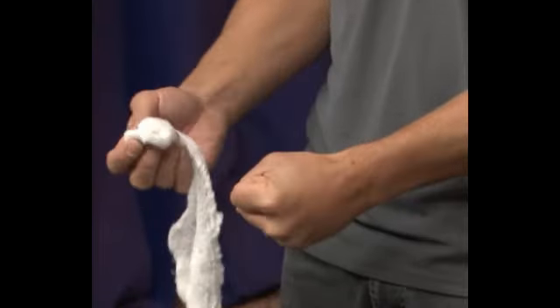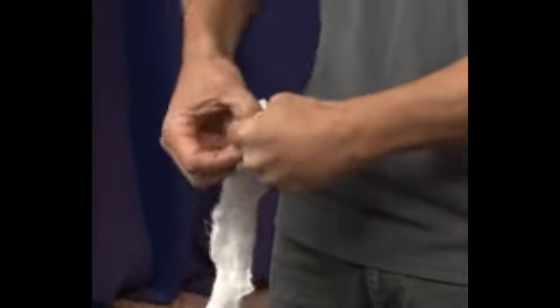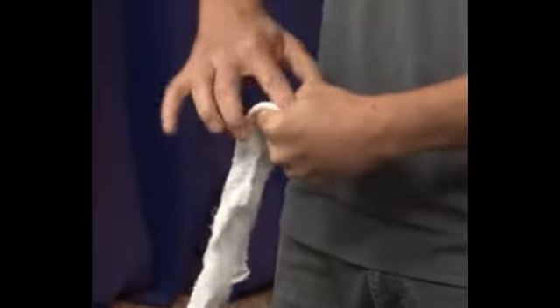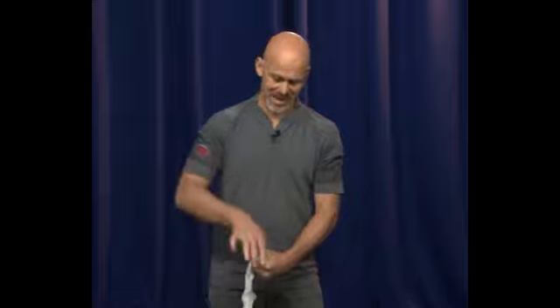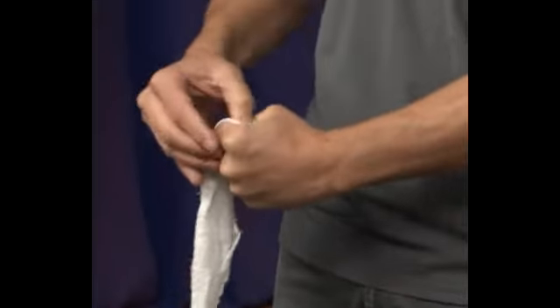I'm simply going to clench my fist down and just start to work this gauze into that clenched fist. I can do that with my finger, I can do it with my thumb. One thing you'll hear people talk about is packing in all directions — not just stuffing down, always curling to one side or the other, but making sure you're pushing into a lot of different directions.